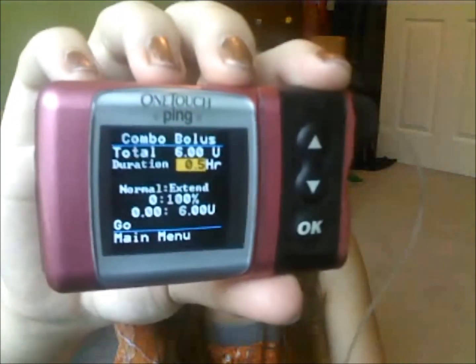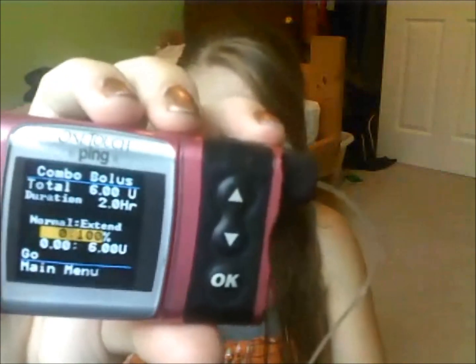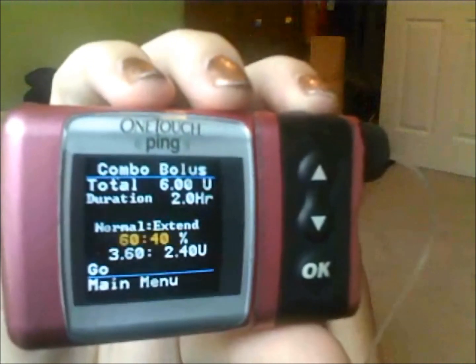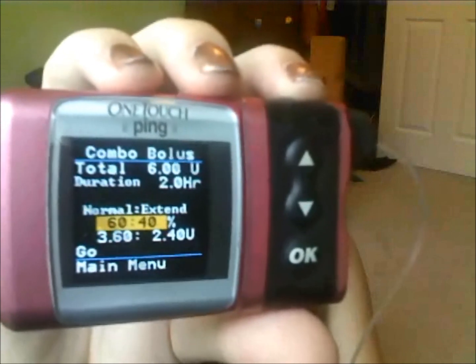And then the next option is how many hours you want it to be spread out over. So I'm just going to go 2 hours. Probably good for me. It's going to be different for everyone though. And then finally you get to choose the percent of insulin that you want now and the percent of insulin that you want later. So I'm just going to say give me 60% of it now, which happens to be 3.6 units, and 40% of it over the next 2 hours, which is 2.4 units. And then you just hit go, and you will have an active combo bolus listed on your screen.